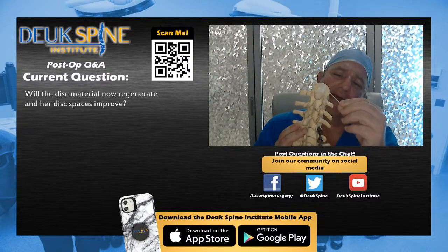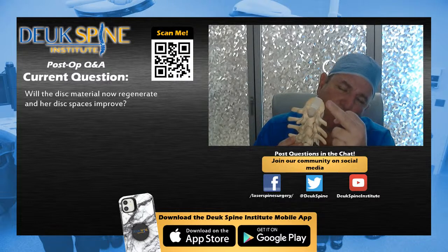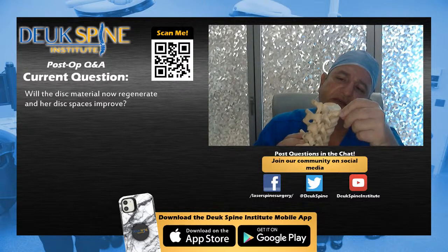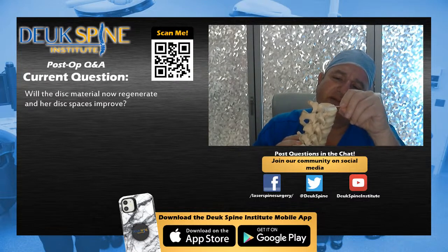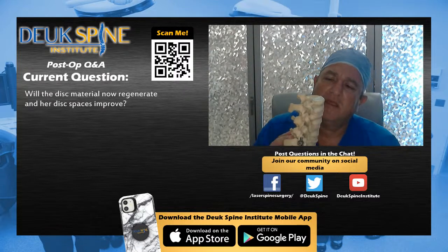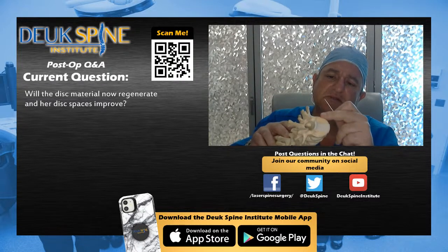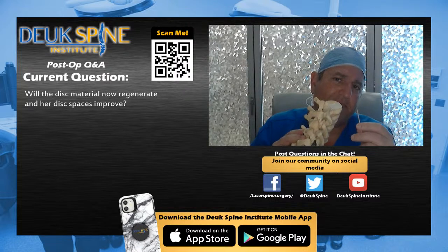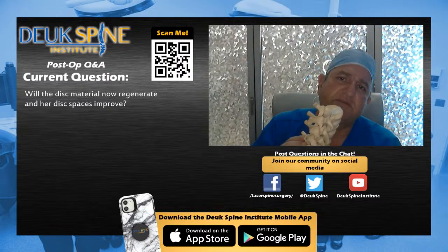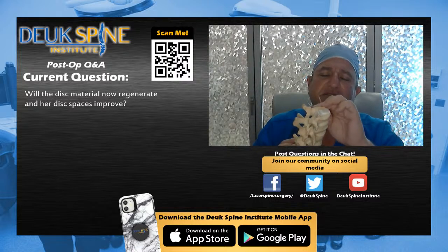So when I'm inside and I'm looking this way left, I see the end plate, that surface there. I look the other way, I see the end plate up here. And then of course the annular tear is going to be right here in this part of the disc. You all see that? Right in the back. That's the back of the disc to the side, back side. That's where the painful annular tears are, okay? If you have an annular tear on the side of the disc over here, it doesn't hurt. Front doesn't hurt. Side doesn't hurt. The only place that people have a painful disc is when it's in the back of the disc, along the back here. And that's because the nerve fibers to this part of the disc are different than the nerve fibers to the sides and front of the disc.